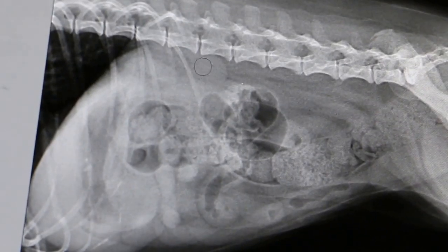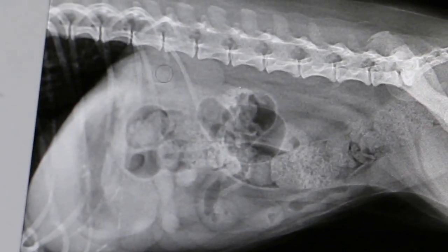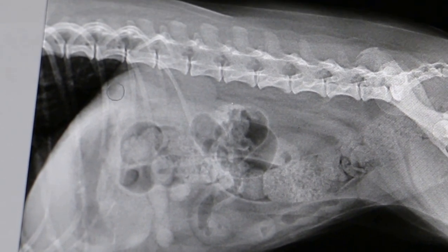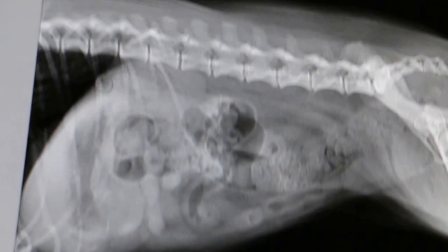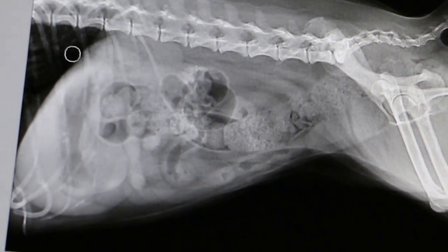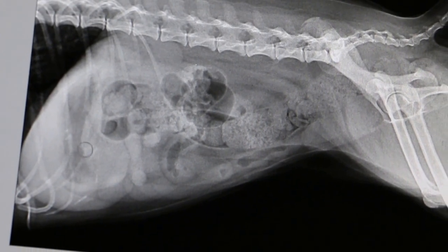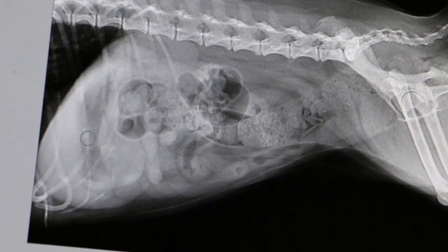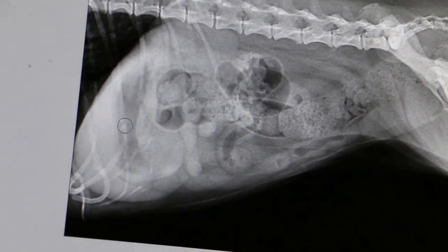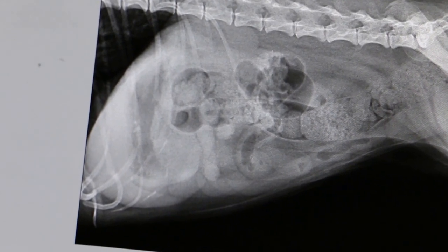From the top view you can see ribs 12, 11, 10, and then 9. You can see them quite clearly here.